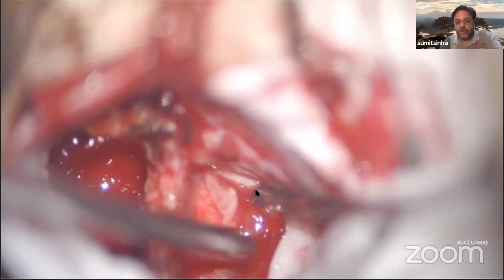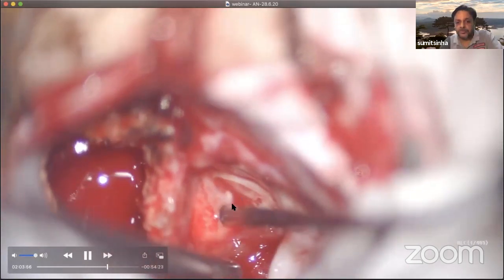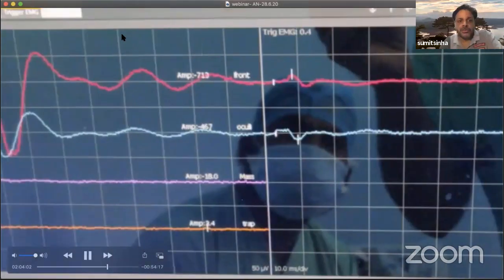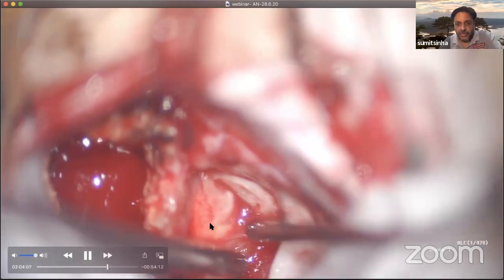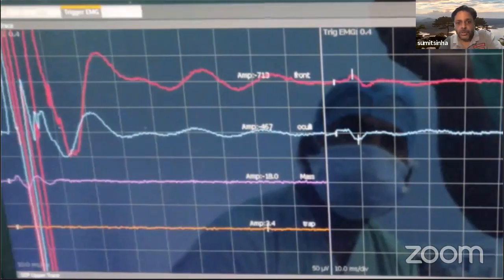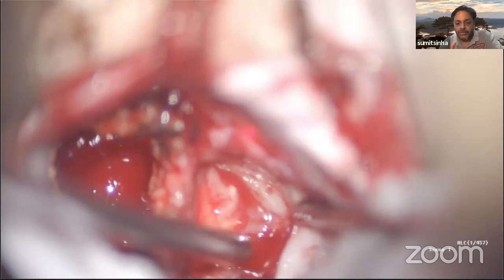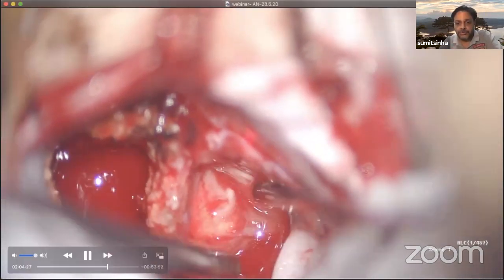You confirm the presence of the facial nerve by means of the neurostimulator, and it gives a response. It gives a good response. As you see over here, this is the facial nerve monitoring, the triggered EMG, I mean. So this is the triggered EMG of the facial nerve. So you have to dissect the tumor sharply away from the facial nerve, I repeat. So this is the most important step when you are near the facial nerve.